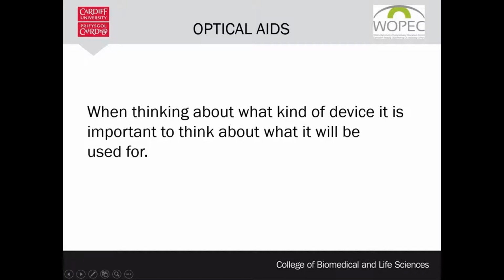When thinking of what device you wish to prescribe, you need to have in mind what the device will be used for and how long it will be used per session. A device meant to be used for sewing or trying to pick out stones from beads will not be the same as the one meant for reading text of a phone top-up card or a phone voucher. Whilst you will need a magnifier which will need less handling when picking out stones from beads, because you may need both hands to do that job and it could take hours to finish, you may not need that kind of aid to be able to read text, which is a task that will last only a minute or less, and you would only need one hand to do that.